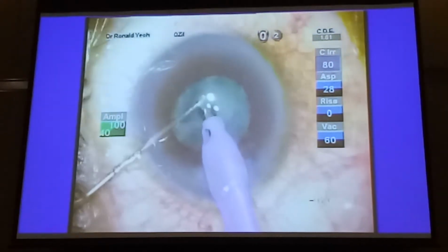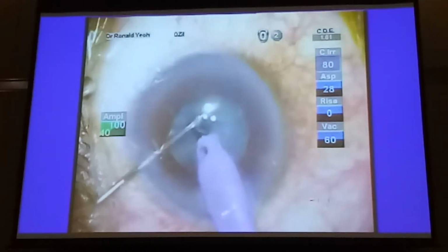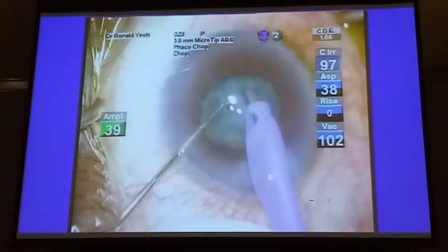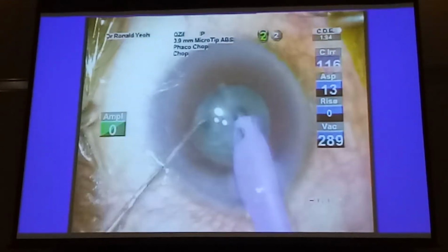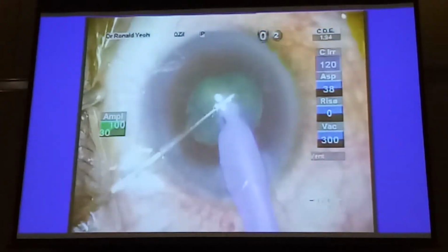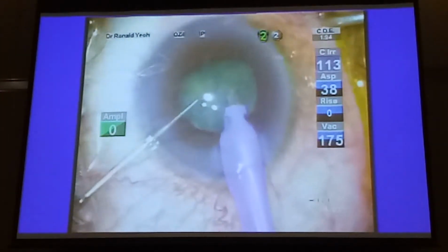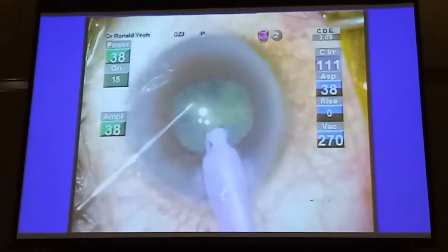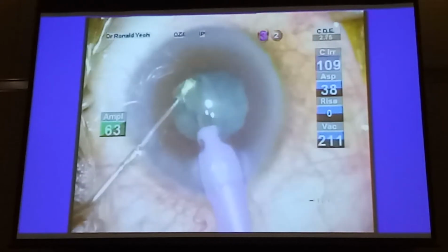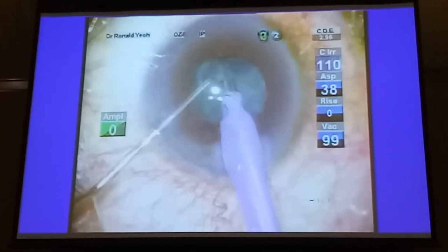Now you can imagine if you didn't have a cracked nuclear fragment, you would struggle a little bit trying to groove and remove the nuclear fragments in a case that's soft like this and with the pupil the size it is. And you can see that once that first quadrant has come out like that, the rest of the operation is really pretty straightforward because the 4 quadrants are free and loose.